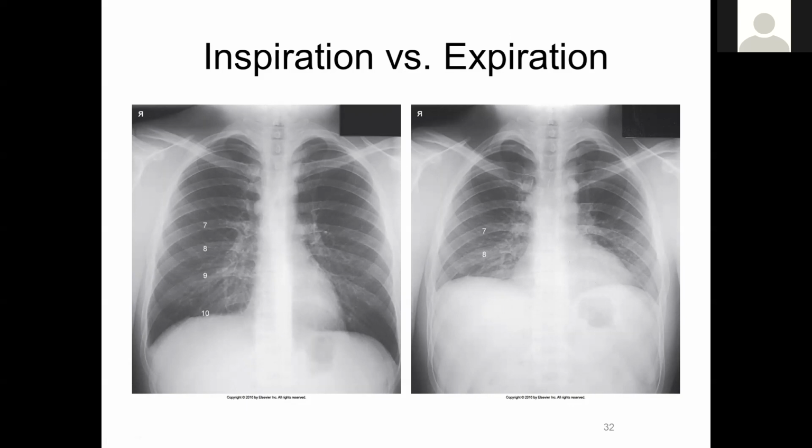You will see this fairly frequently. Even though you give very good breathing instructions to your patient, they may not follow them. So when you are evaluating your image and you have given instructions for inspiration and you end up with something along the lines of this image, you will need to repeat it, because perhaps they didn't follow your instructions very well.